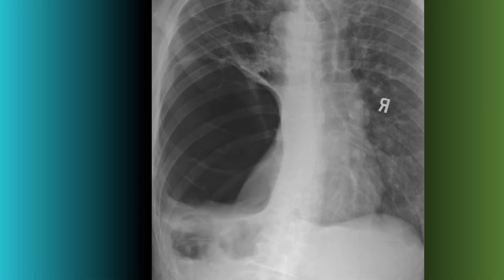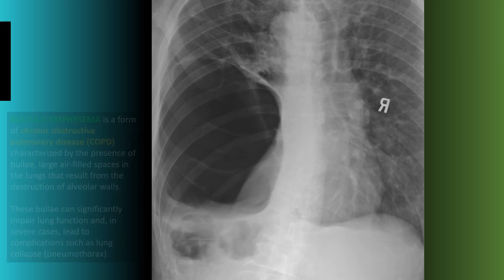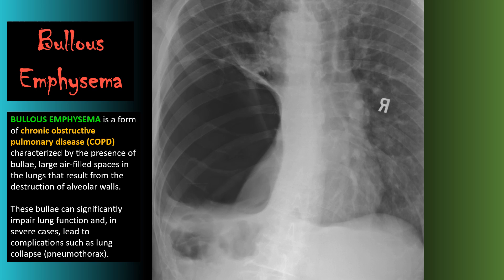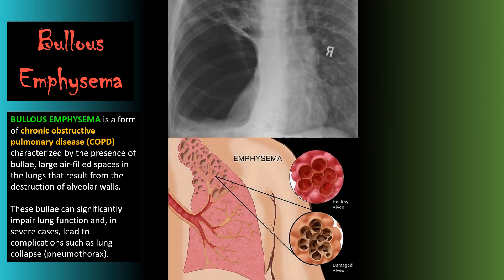On this frontal view of the chest, you should see a very large cyst-like lesion within the left lower lung field that looks devoid of vascular markings. This large cyst-like area of dead space is referred to as bullous emphysema — a form of chronic obstructive pulmonary disease. With bullous emphysema you can see these large air-filled spaces in the lungs that result from the destruction of the alveolar walls, which can lead to significant pulmonary issues.